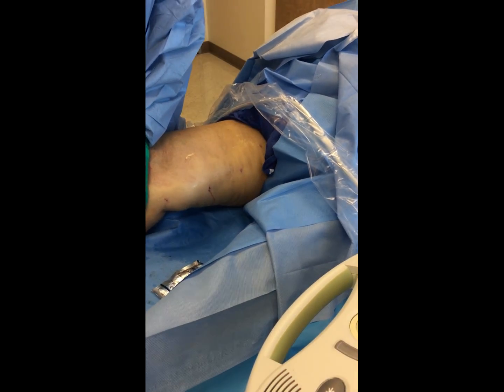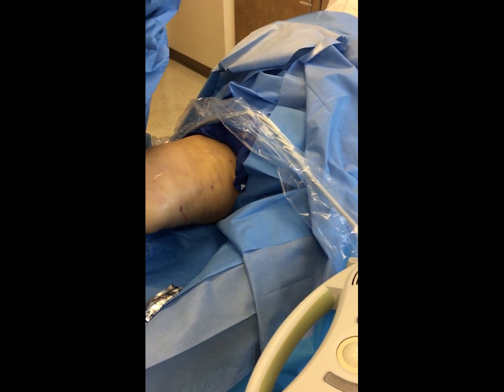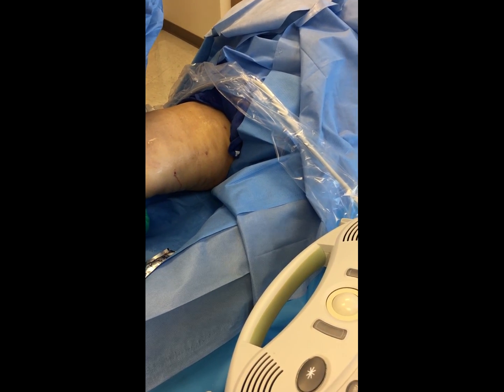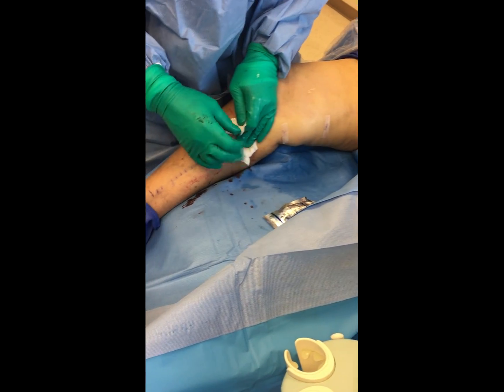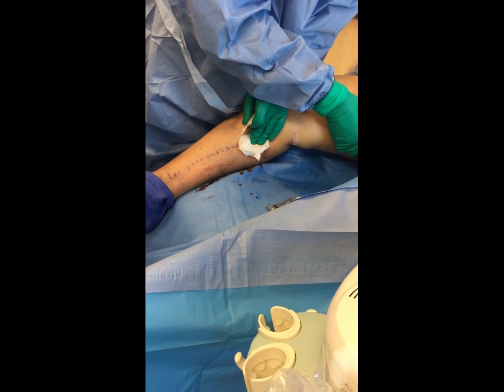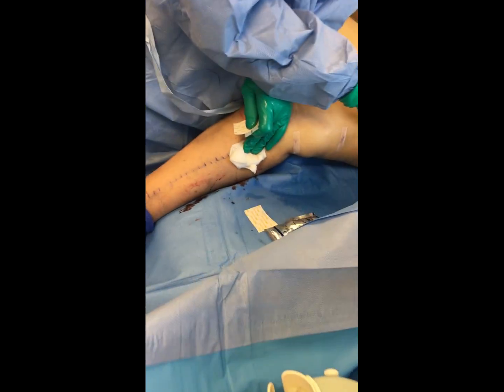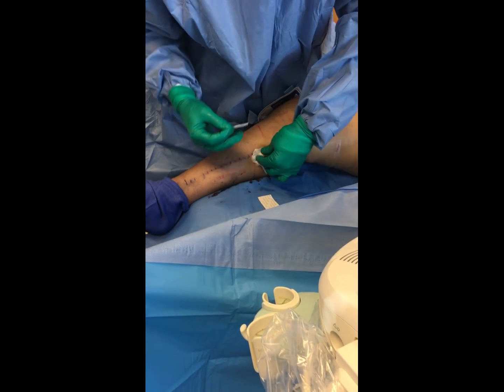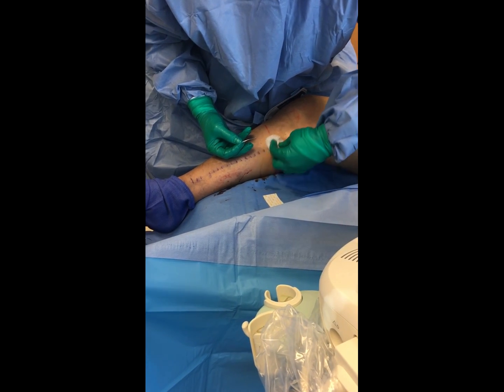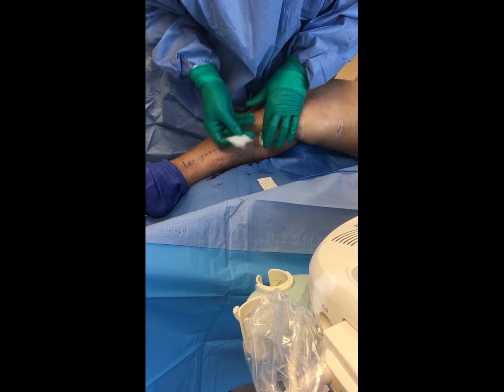How was that? Did that hurt? She said just a little bit — poquito. Her knees actually hurt because of her arthritis, so it wasn't even the procedure. They're going to wrap the patient up now.